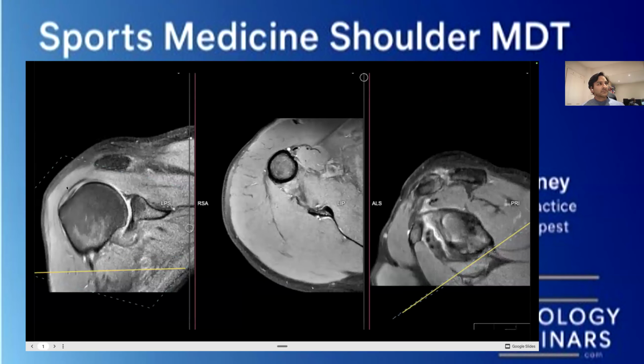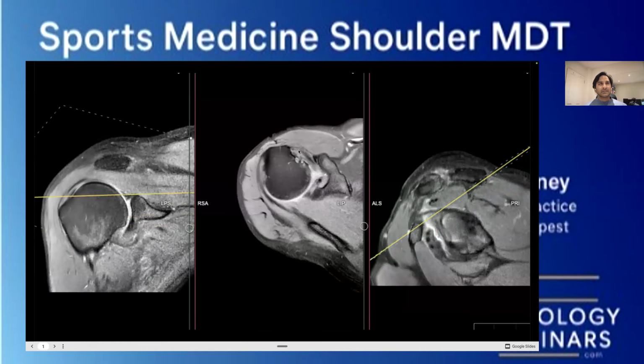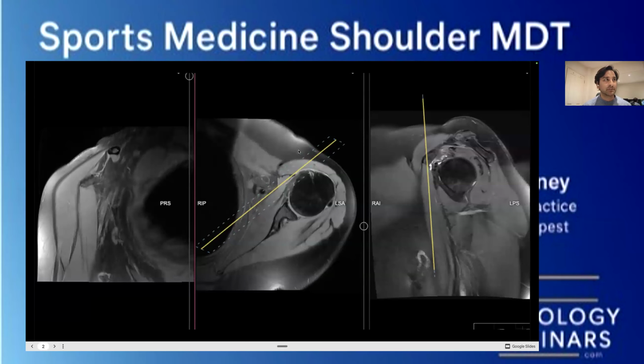The other thing I wanted to point out is that biceps tendon that we were looking at earlier. Similar thing, biceps tendon should be very, very black, but it's not very black. It looks a slightly odd color, looks a bit different as you come down like this. Sometimes you get something called a magic angle, which just means that when you take the image at a specific angle, it looks a bit bright. But this one feels like it goes on for a little bit too long, and therefore you've got to be concerned there could be a certain level of inflammation located in that area as well.